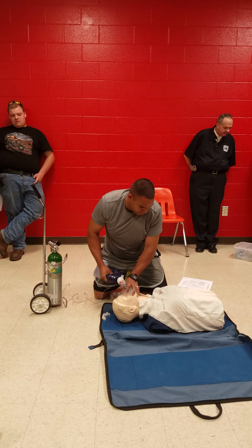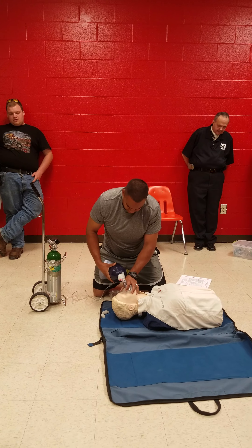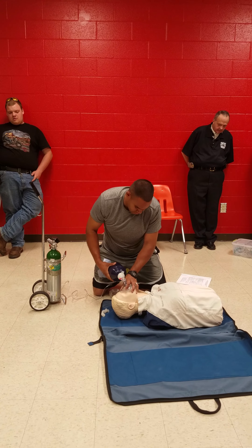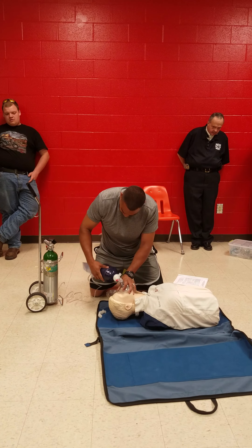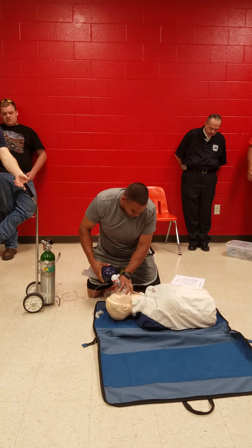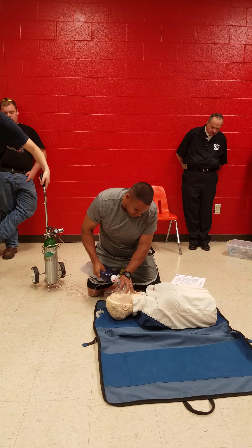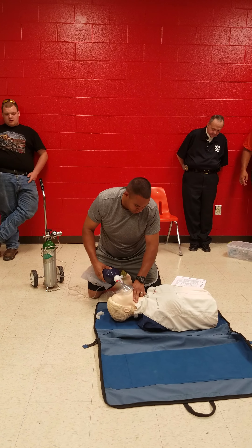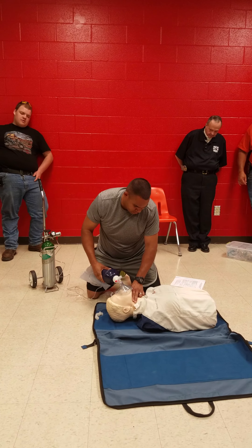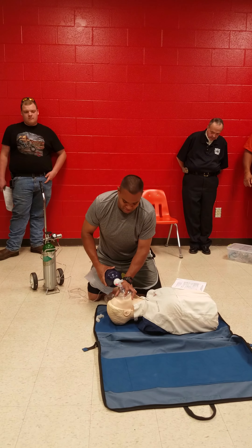They want to see good chest rise for 30 seconds. Being a competent EMT, he's going to be checking for spontaneous pulse and making sure the patient still has a pulse. All right, second rescuer is on scene.